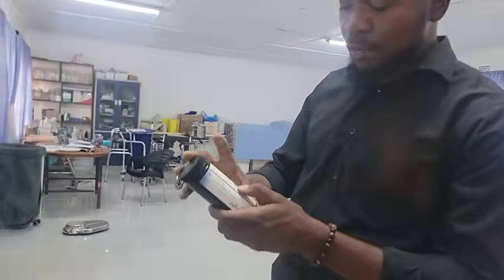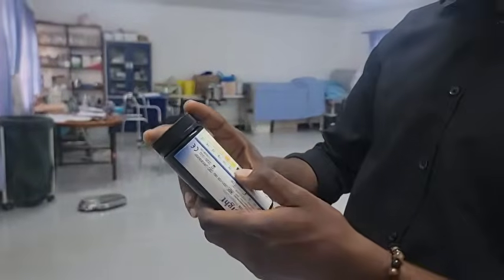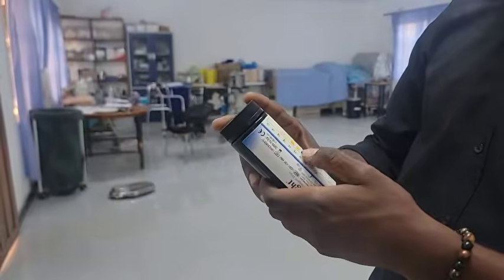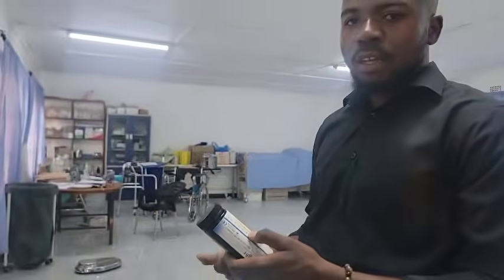That's for specific gravity. What of blood? So if you do urinalysis and you find that blood comes out positive, that may simply indicate that there is trauma to the kidney, the urethra, or the bladder itself.